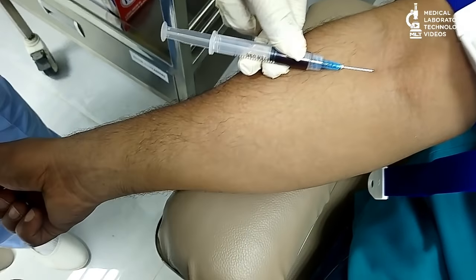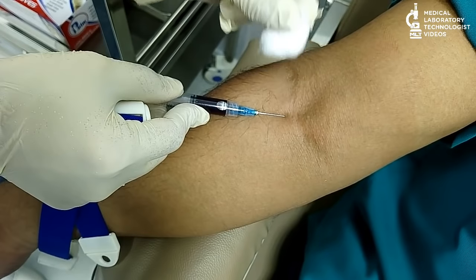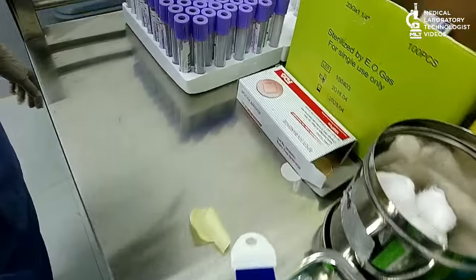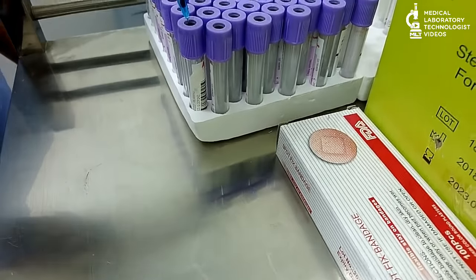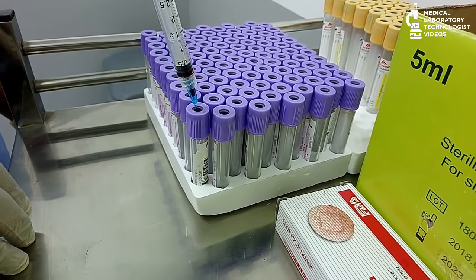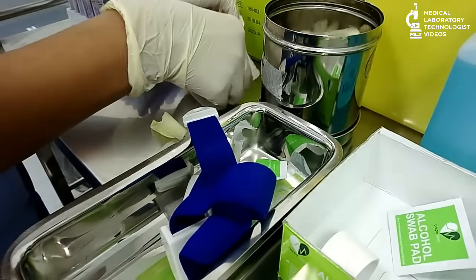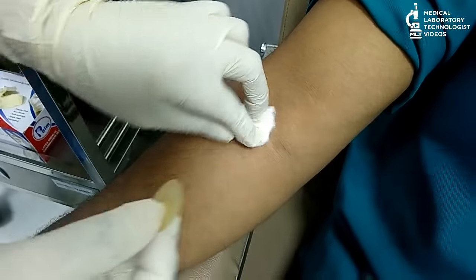Then, withdraw the blood. After that, tell the patient to open his hand and remove the tourniquet. Then, put the cotton in and tell the patient to press for one minute. Then, draw the blood into the bottle. Finally, attach the spot bandage to the patient.